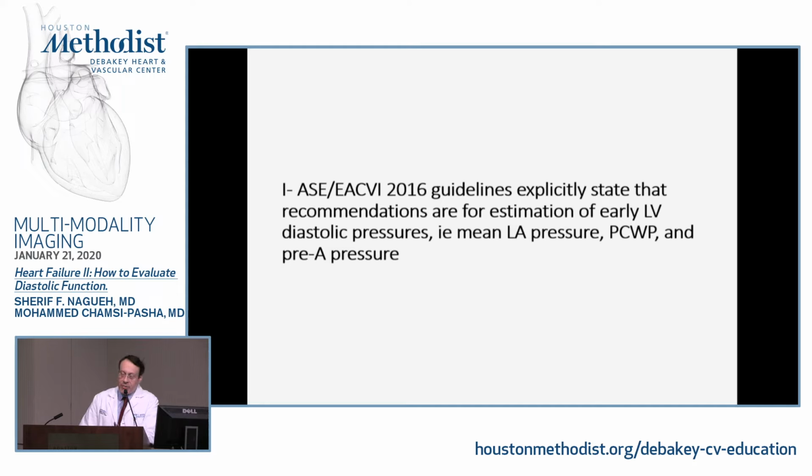Because there are so many pressures that we talked about, as you saw in these slides, it's important to say what pressures we seek to estimate. Because the mean wedge pressure and the mean left atrial pressure, which is tied to the mean wedge pressure, and the pre-A pressure, all are the ones that determine whether someone has shortness of breath or not. The goal is to estimate these pressures, not the late diastolic ventricular pressures.